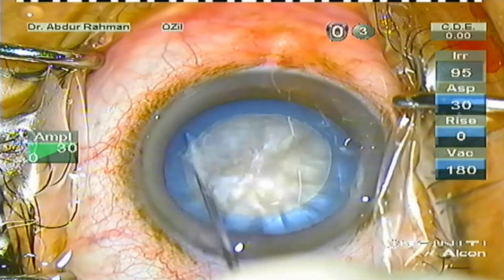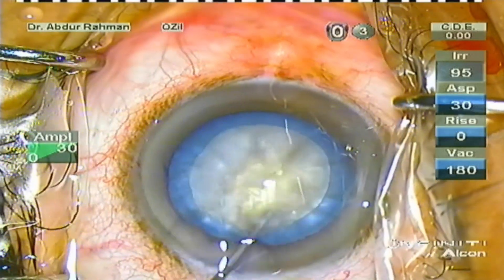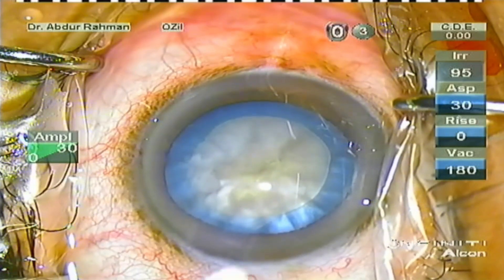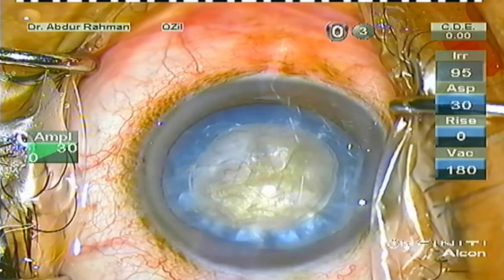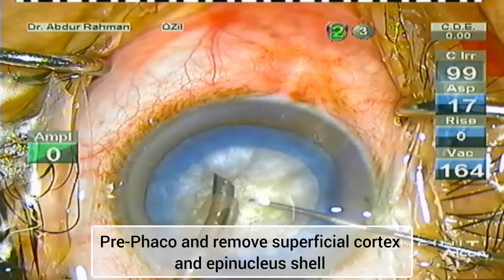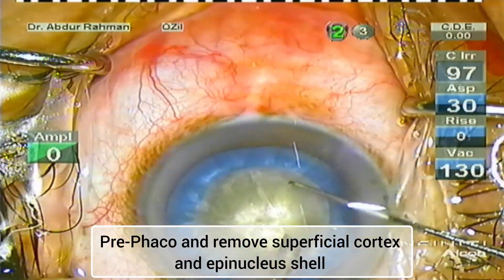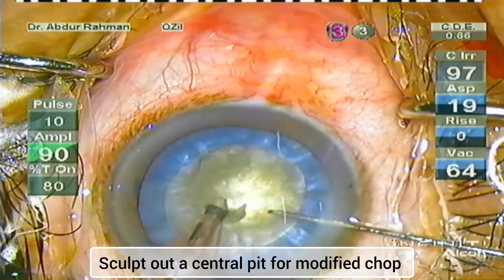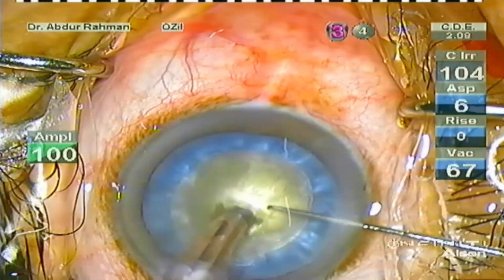Now I'm performing hydrodissection, tapping the nucleus and rotating the nucleus with the hydro cannula. Now I refill the anterior chamber with OVD again. Now I press the phaco handpiece and the Sinskey inside the anterior chamber.